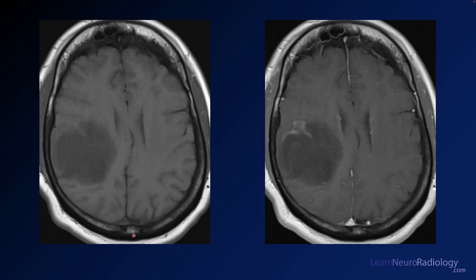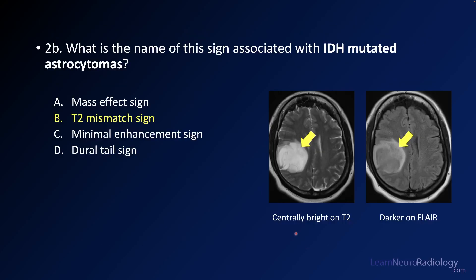Here you see your pre- and post-contrast images — again a relatively well-delineated mass with some mass effect, but not a great deal of enhancement. You have some enhancement along the anterior margins of the tumor. A little intermediate amount of enhancement makes you think this is probably going to be a low to intermediate grade tumor. The central portion is very bright on T2 but darker on FLAIR — that's the T2 mismatch sign.